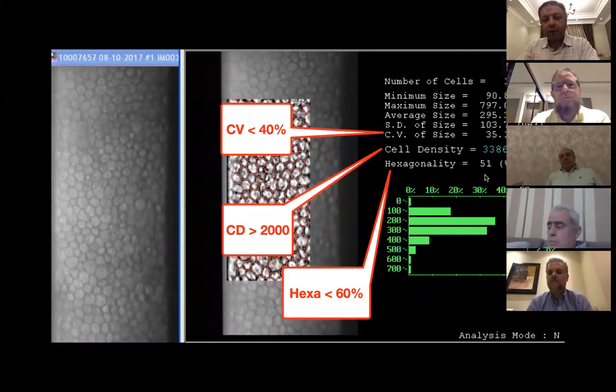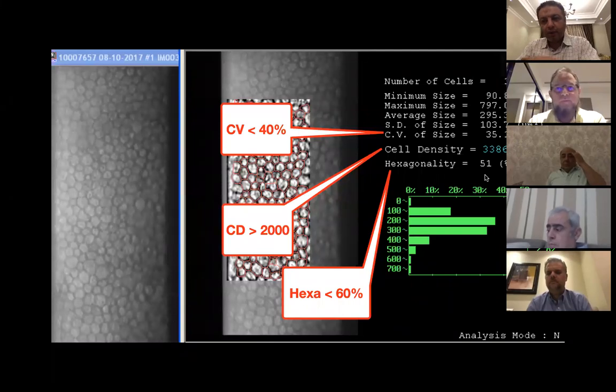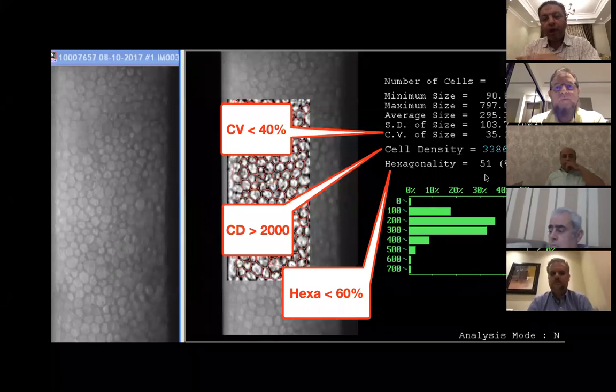If you put in a phakic IOL, you may expect that there are some changes in the first weeks after surgery. Yes. Loss of endothelial cells. Yeah, but after time, it may be compensated. It may pass well. If the changes are still present or progressing over time, I have to ask for specular microscopy at intervals after surgery, after 1 month, after 3 months, and so on.